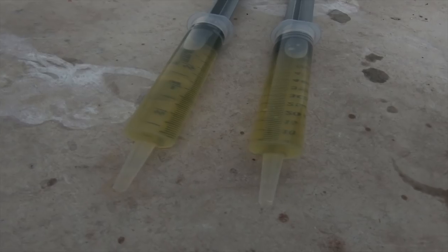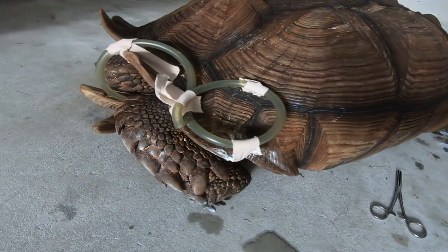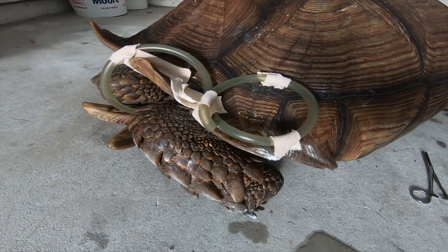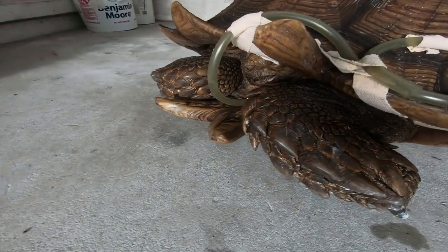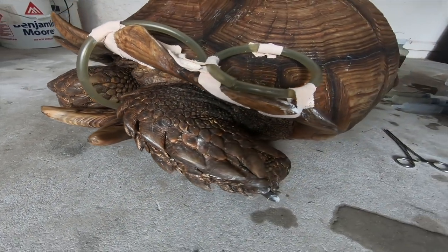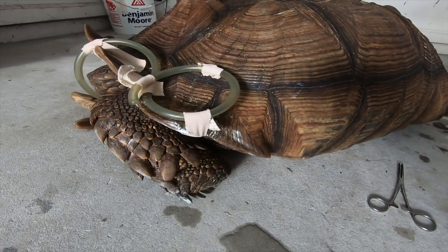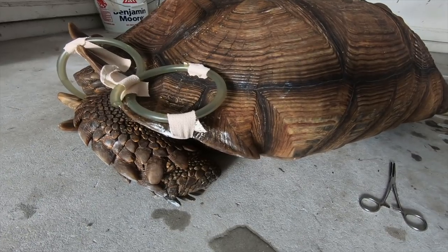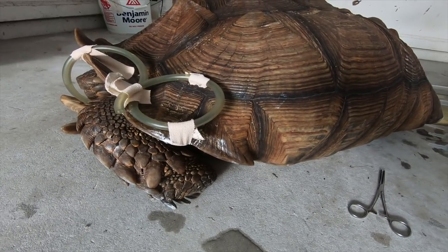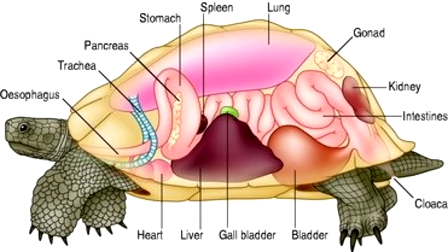we actually did a blood test, which is one of the first things you want to do, because the blood test after the x-ray is going to be critical in figuring out what's wrong with the animal. And the blood test came back that the animal's dehydrated. So as we know, tortoises, even though they're desert species, these animals need water. And so for whatever reason, it could have been a parasite that was causing him not to drink and therefore slowing down his intestines, slowing down his kidneys. We don't want this animal to go into renal failure.